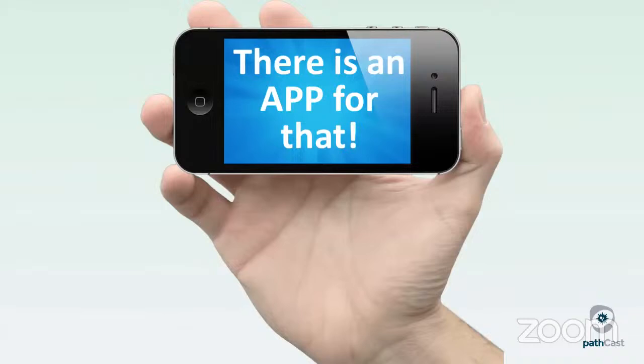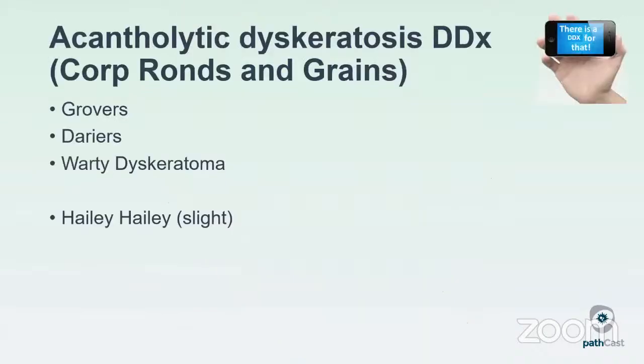I don't know if some of you might be old enough to remember the old iPhone commercials where they'd say, there's an app for that. I love differentials in derm path. I'm always saying, wait a second, here's a clue, or here's a reaction pattern. I know a differential for that. Let me pull up my differential so I can start running through what this entity could be. I call this, there's a DDX for that. The DDX for acantholytic dyskeratosis is a trio, really: Grover's disease, Darier's disease, and warty dyskeratoma. And then I add Hailey-Hailey. It's not one of the big three, but you can sometimes see a little bit of acantholytic dyskeratosis in there.